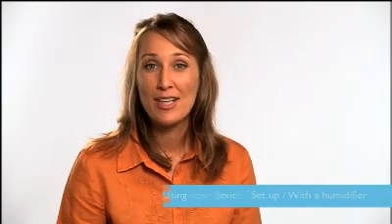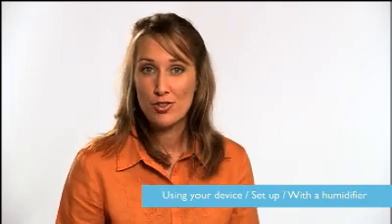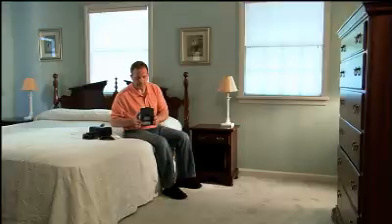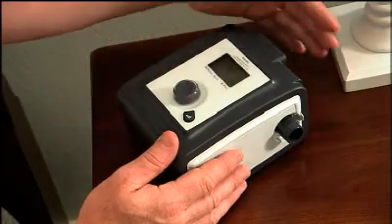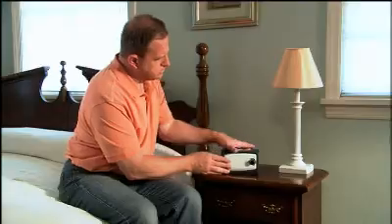For the best results, set up and use the device on a firm, flat surface, such as a sturdy nightstand near an electrical outlet. The system should be slightly lower than your bed and within easy reach. Make sure that air can flow freely around the device. Also, keep it away from heating and cooling equipment.